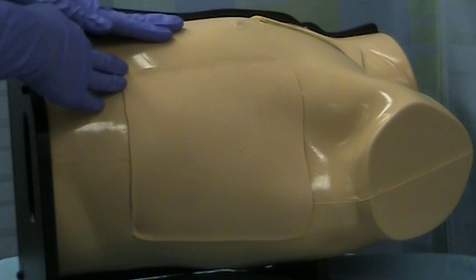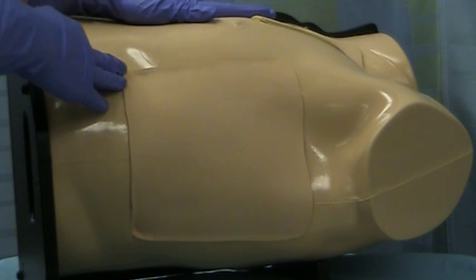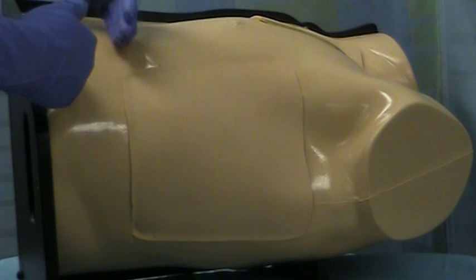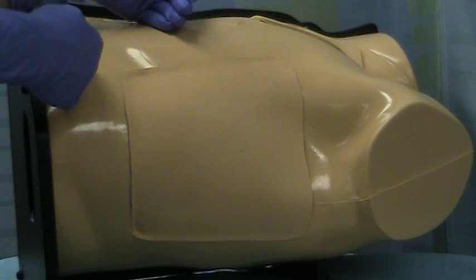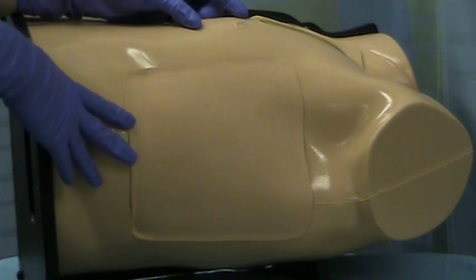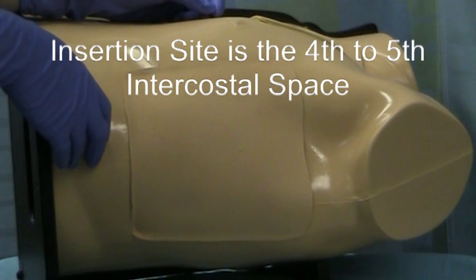However, we also need to remember that there are several very important vital structures within the chest that we need to make sure we avoid, and also remember that there is an overlap between the abdominal and chest cavity, and we certainly don't want to place a chest tube into the abdominal cavity or into any of the abdominal organs. That means that we have a very specific area in which we're able to place a chest tube that will keep all these structures safe and then still treat our patient's abnormality.